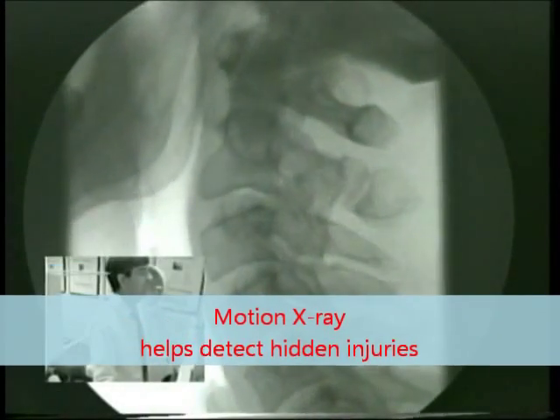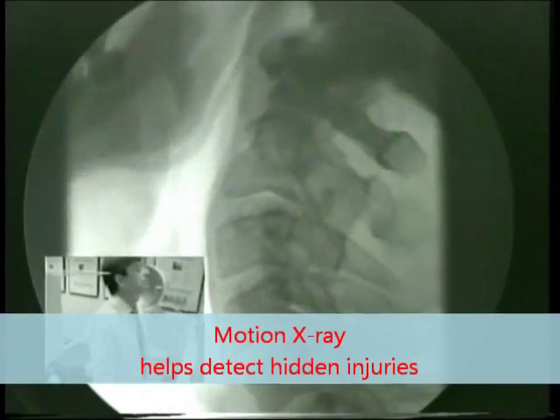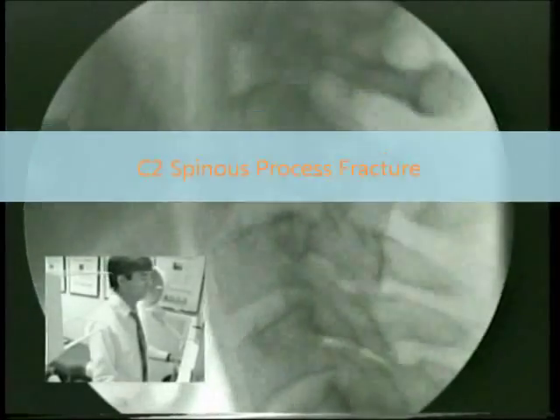This study demonstrates a fracture of the spinous process of C2 following a car crash. This injury was missed on plain films.